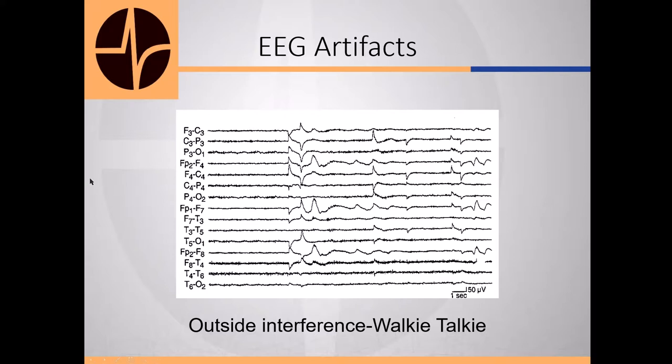This is outside interference. It was determined to be a walkie-talkie, but you will see this sometimes in microscopes and in the headlamps. It has a really odd look. It doesn't look like EEG.